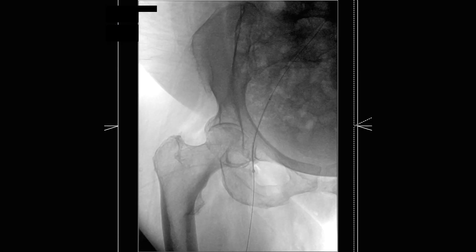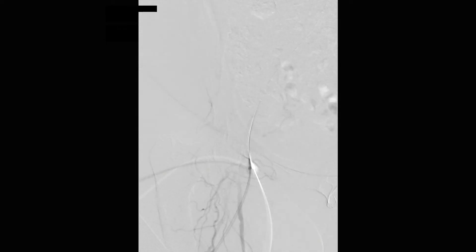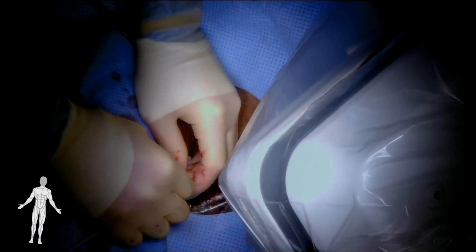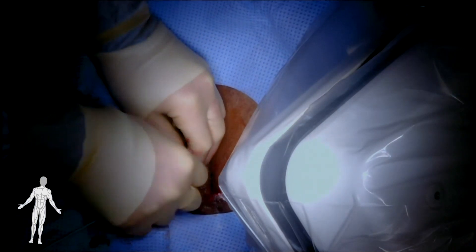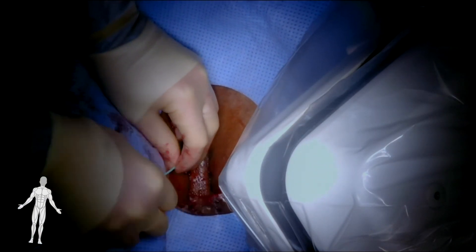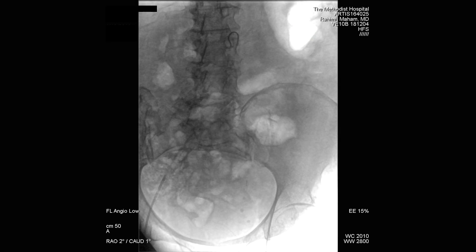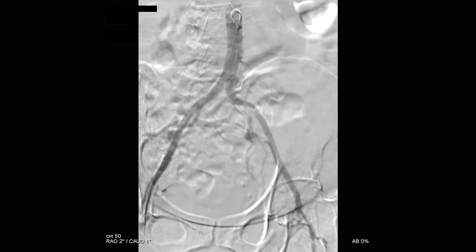Contrast is injected to perform digital subtraction angiography of the access vessel to ensure that there are no access complications. A contra catheter is then advanced over the Benson wire in order to facilitate an abdominal aortogram as well as access the contralateral limb. The catheter is then positioned in the infrarenal abdominal aorta and DSA is performed with injection of contrast through the sheath to visualize the aortoiliac system.